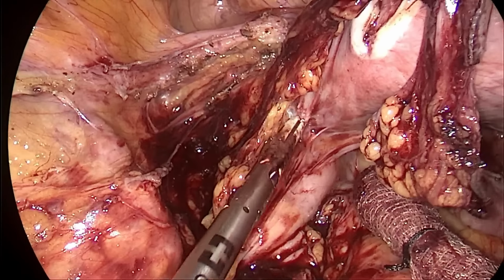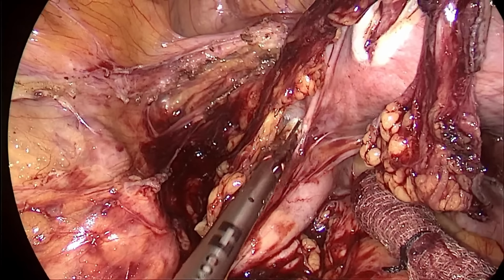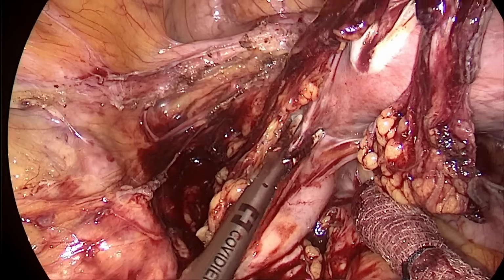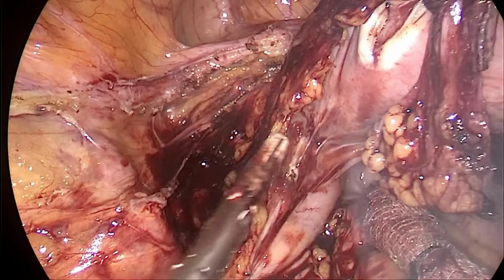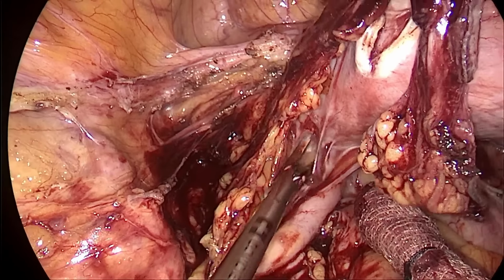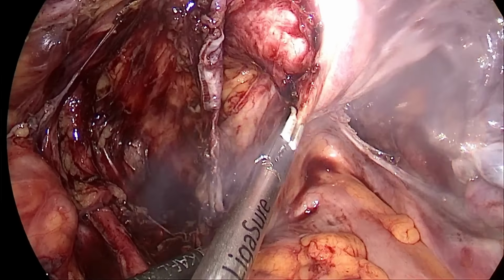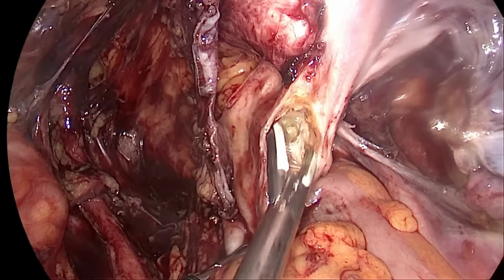Now going posteriorly into the rectovaginal septum. So that's an avascular space, so if we go correctly there will be hardly any bleeding there.